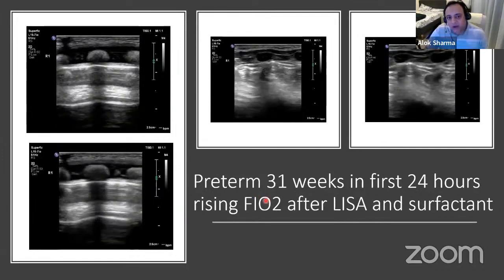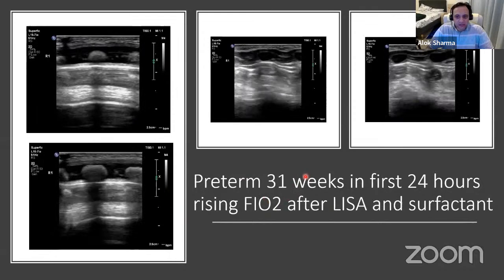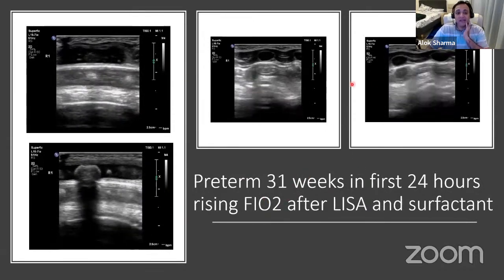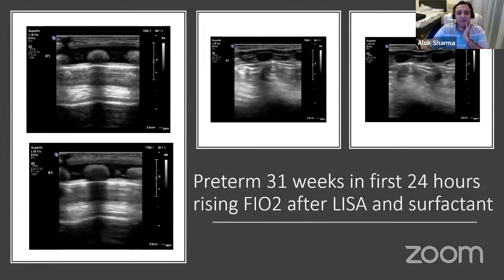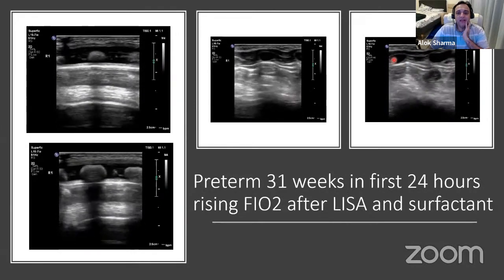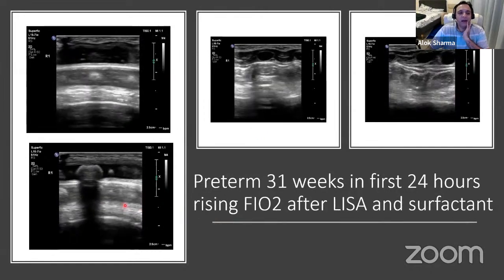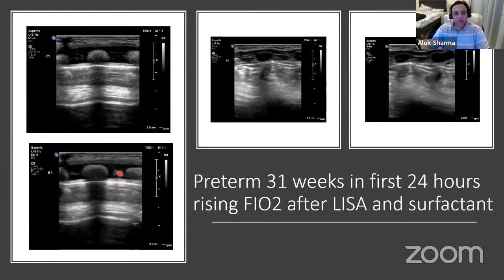Classically, what you need to do is optimize your settings. Otherwise, it can make it very difficult to interpret. What you're seeing here as breakdown is actually mirror image ribs. So that's the rib, this is a mirror image rib. That's the rib, this is a mirror image rib. And your pleura is not sliding, and it's not sliding over there either. So you'd do an M mode on this.